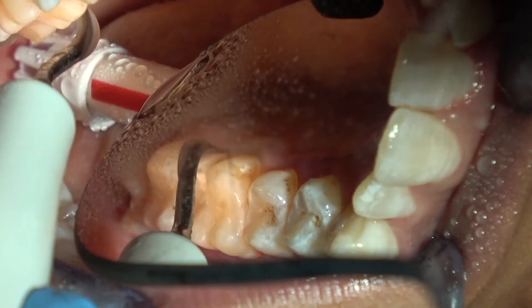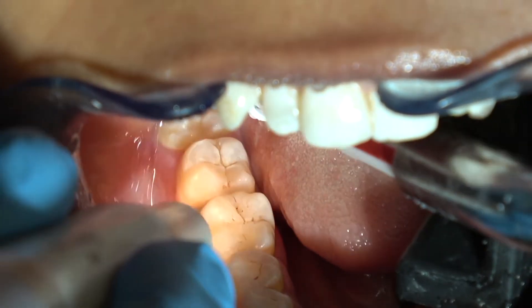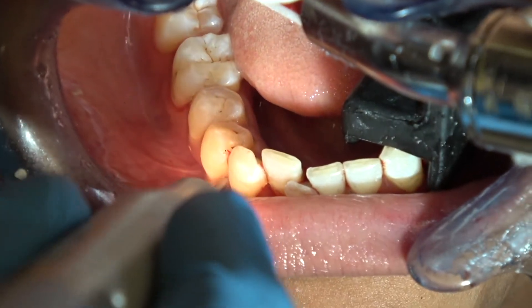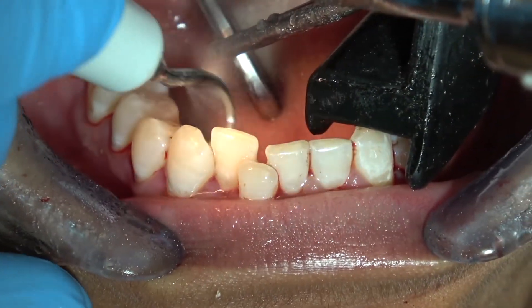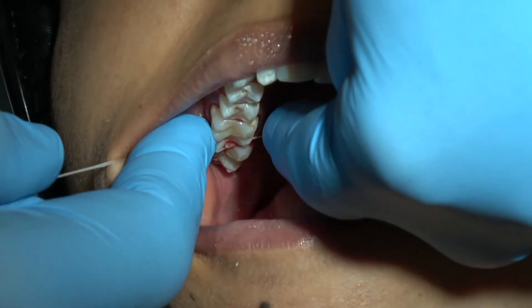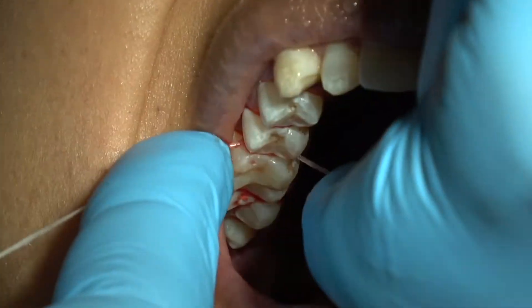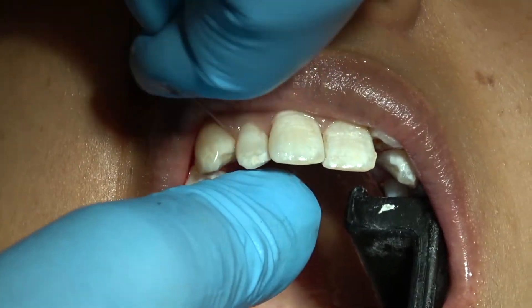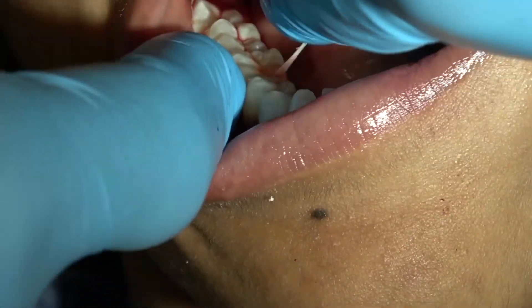She's going to show them how to do it, then watch them do it. We continue removing any calculus and plaque, especially anything subgingival, with the ultrasonic while the patient is anesthetized and sedated. Once done, and especially once they've seen the hygienist for fine scaling, polishing, and oral hygiene instruction, those gums tighten up, get pink and healthy.